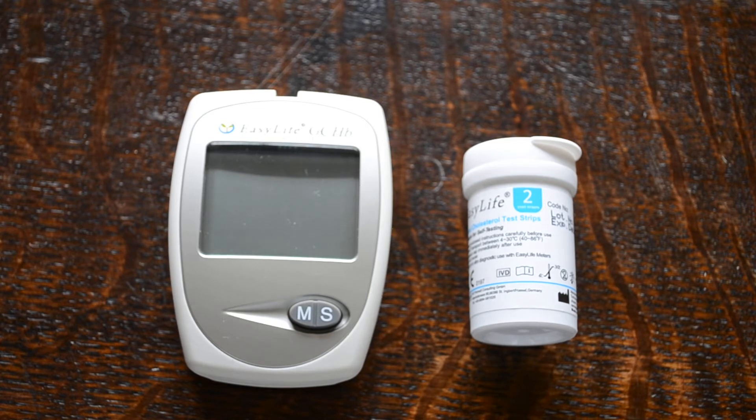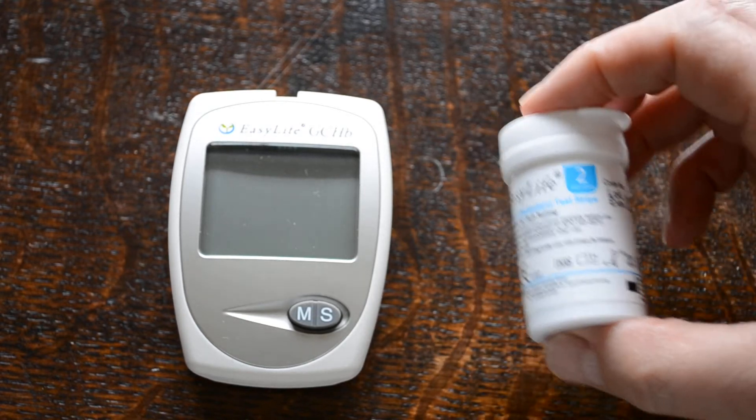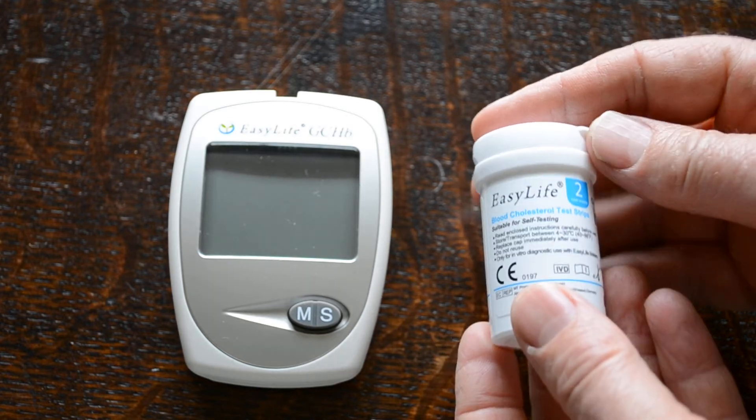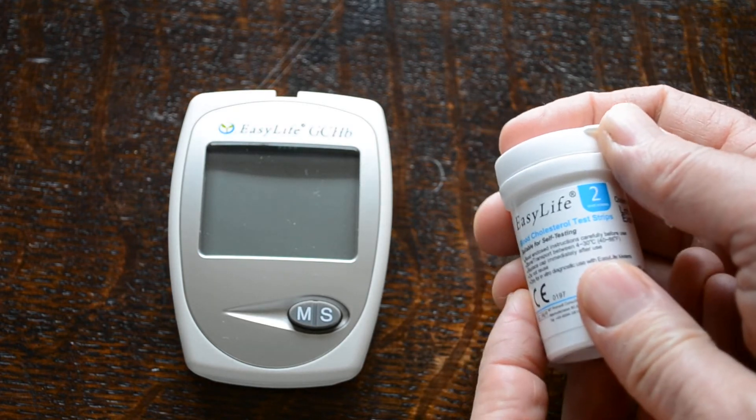The batteries are already in this meter and it's been programmed with a time and date, so it will automatically record the level of the reading and keep that in the memory function of the meter. These are the standard test strip packs that come with the system — you get three different types: test strips for glucose, cholesterol and haemoglobin.